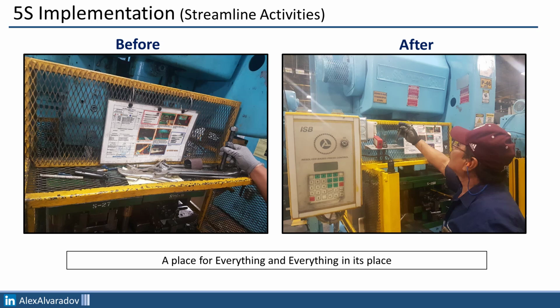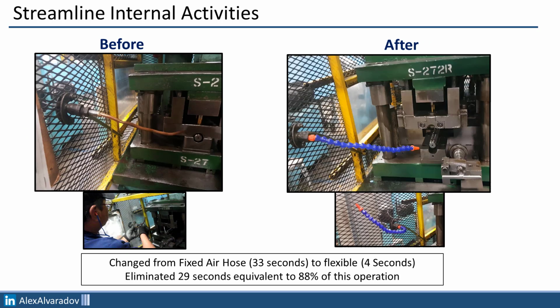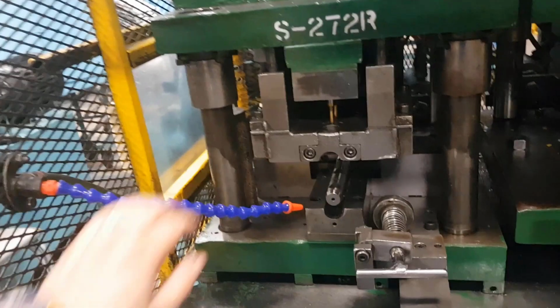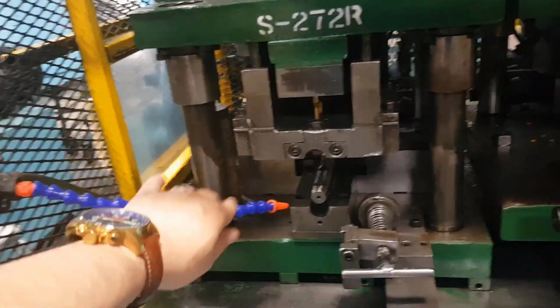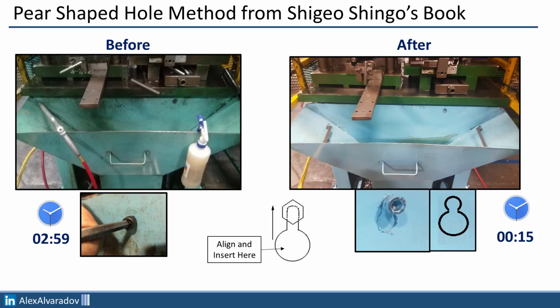As we saw on previous slides, they haven't applied 5S on this machine, so all the tools didn't have a proper place to be stored. After the improvements, a holder was installed to store all the tools and bolts needed during the changeover. Another improvement proposed by the team was to replace this metal air hose by one made of plastic. Before, they had to use pliers to remove and put back the hose, and now they only have to move the hose by using their hands, and then you can take off the dies.